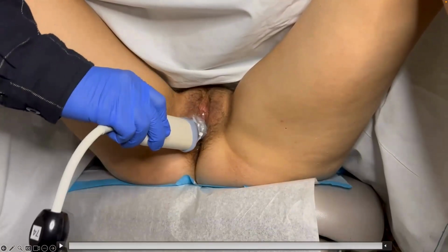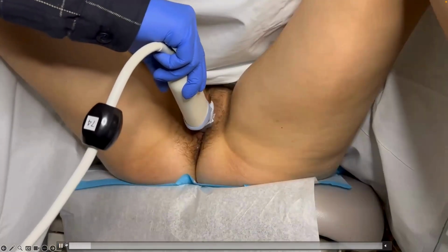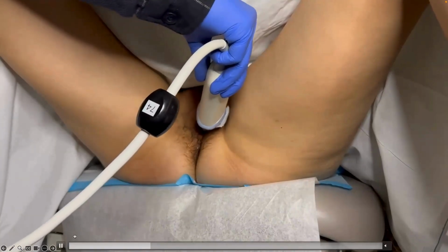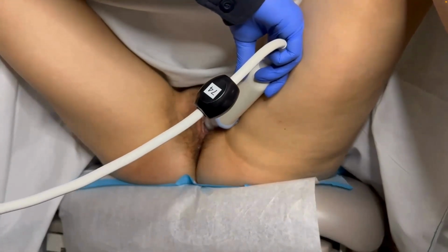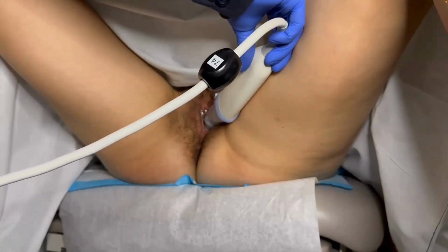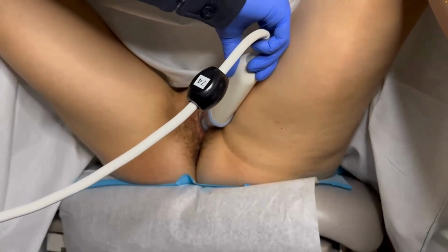In order to find the other side, you simply do the opposite. You move the probe to the patient's left leg, which then allows you to angle the tip of the probe to the right uterosacral ligament. And you see there is a very slight rotation of the probe towards the medial aspect. The notch on the probe rotates medially.